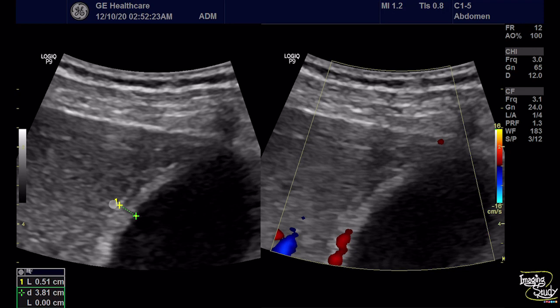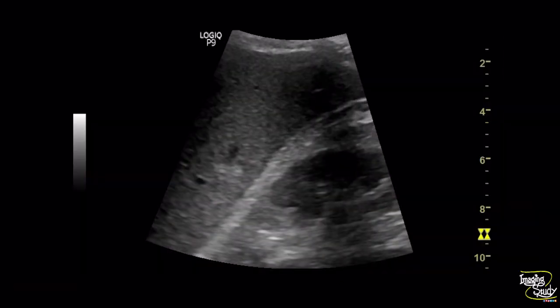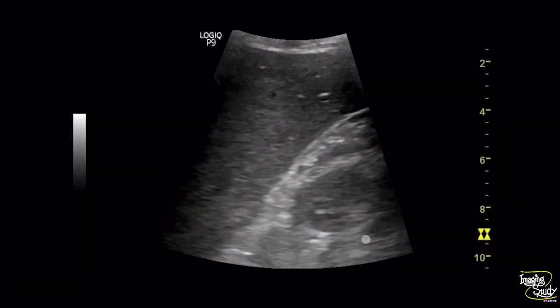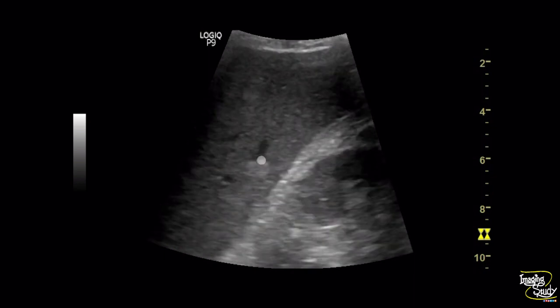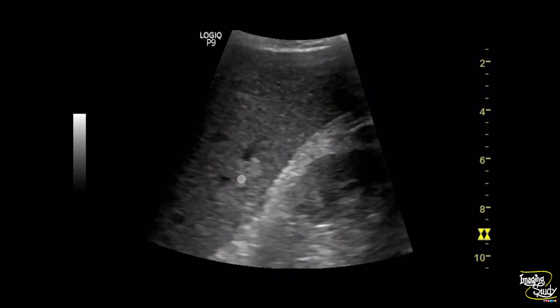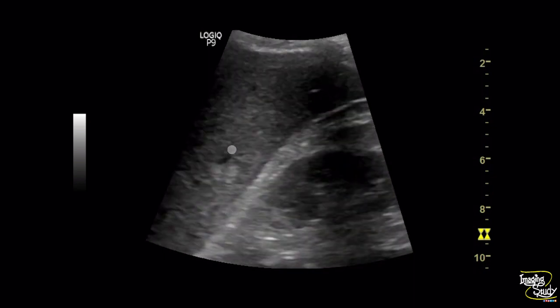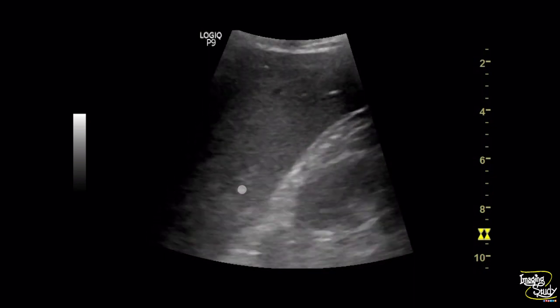The wall thickness is around 5 millimeters. With color Doppler ultrasound you can see a good amount of flow supplying the gallbladder wall. If you look at the liver carefully, you can see a small hyperechoic lesion at the hepatic parenchyma.